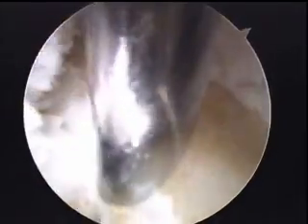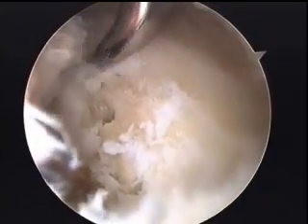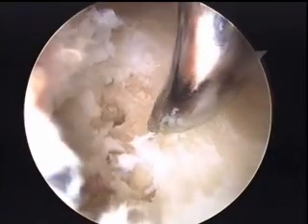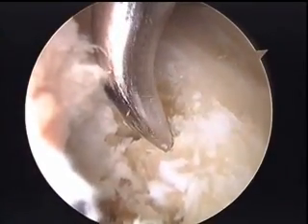Now we're going back on the other side of the labrum to continue our microfracture, and that's just about at the tip of the rim where we will be bringing our labrum back down.